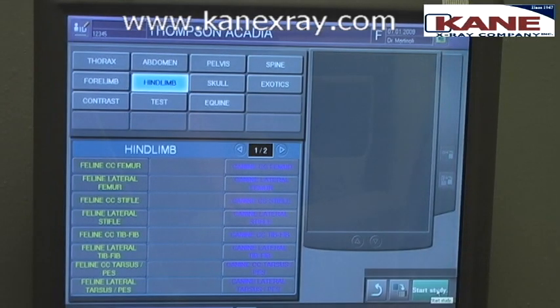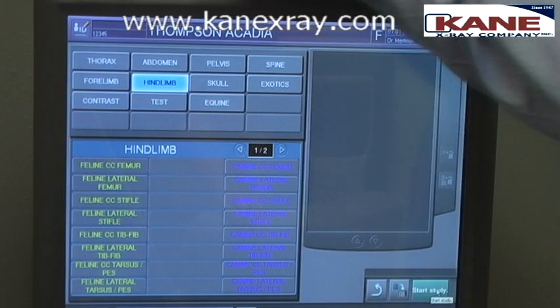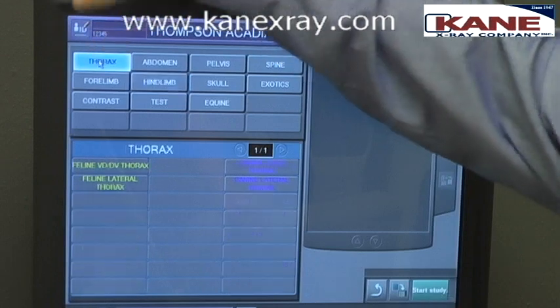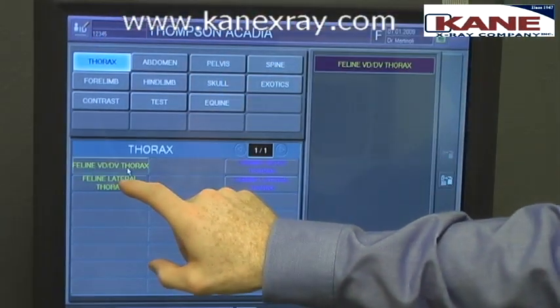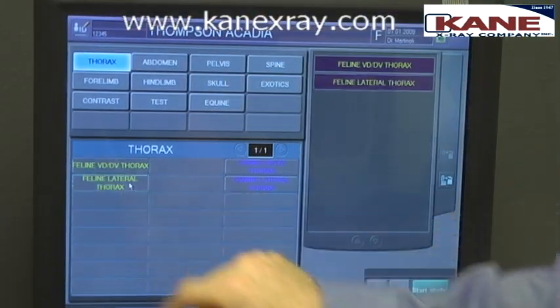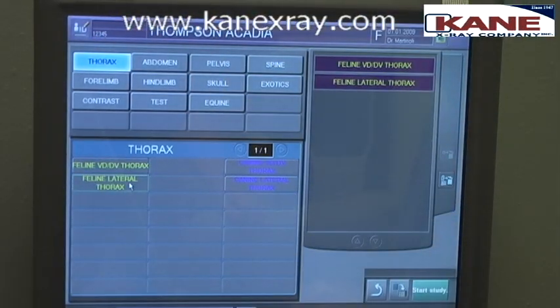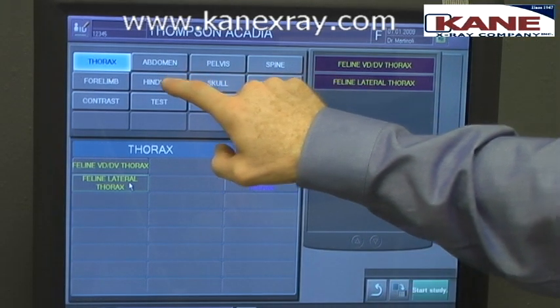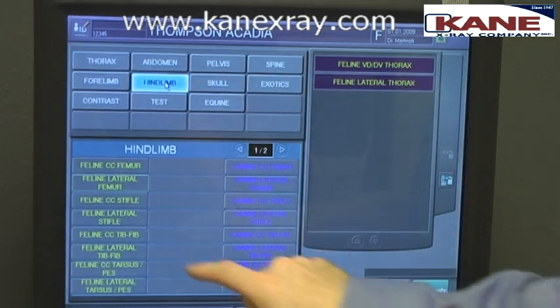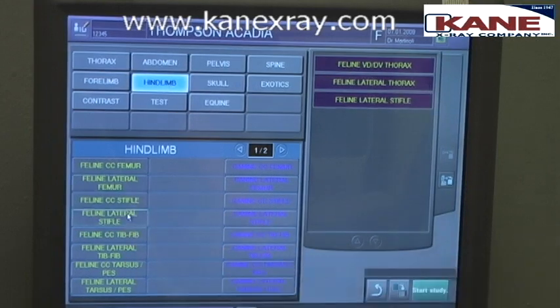On our second screen, we're going to tell the system which views we're going to be taking. For example, if we're doing a two-view chest on a cat, we would hit thorax and add the VD and lateral view for our cat. If we also wanted to add a lower extremity, we could hit hind limb and add the stifle view for the cat.